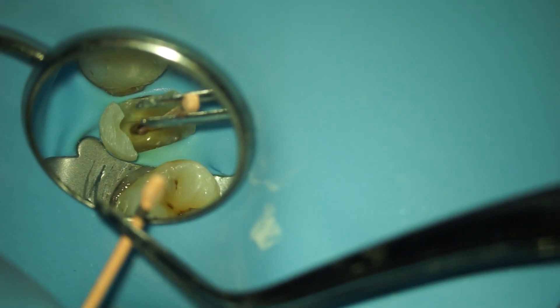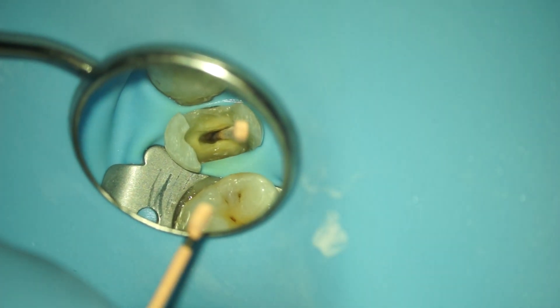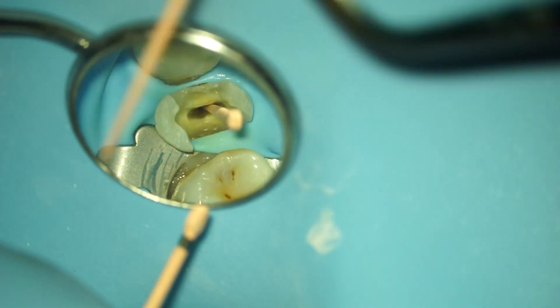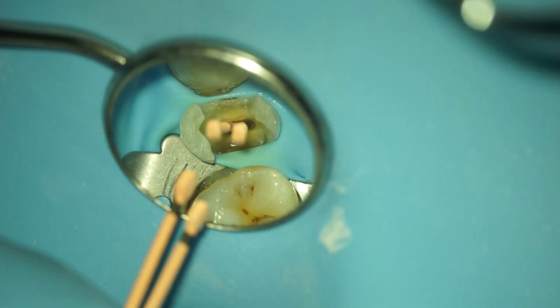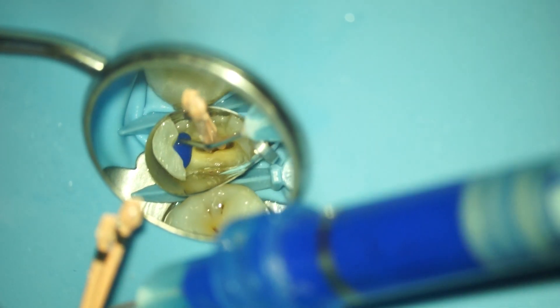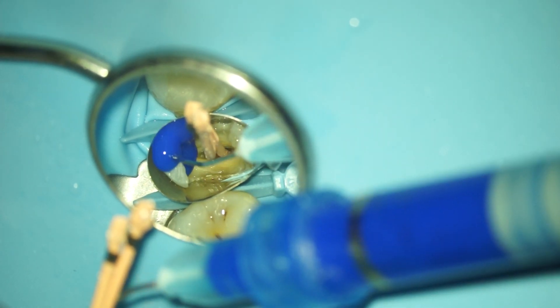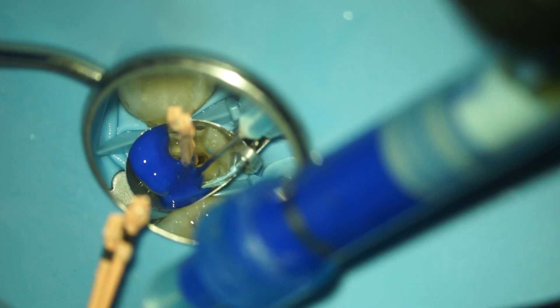Now for the pre-endo buildup, I always make sure that I will not block the canal. As you can see, I put in some gutta percha cones to block the canal so it will not be filled with the buildup material. In the next part, I am etching because I'm going to do the buildup with some dual-cure composite resin.